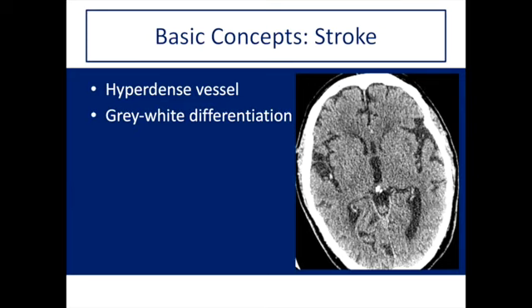As a result, they can't function, they can't make ATP, and their sodium-potassium ATPase stops working. As a result, the cells themselves swell up, what we call cytotoxic edema. In other words, their water content increases. We know water is less dense, so the density of the gray matter in the area is going to go down and look similar to the white matter.